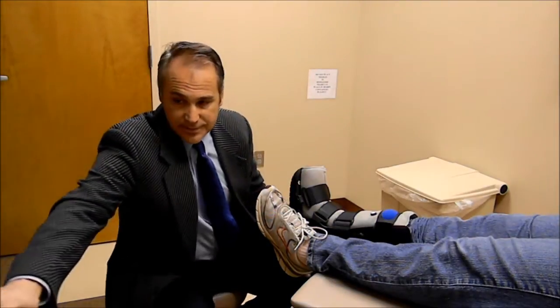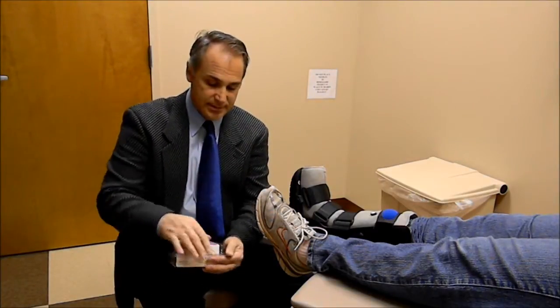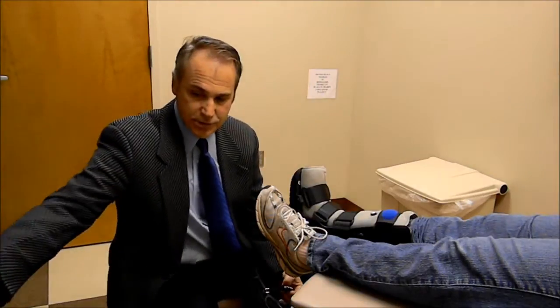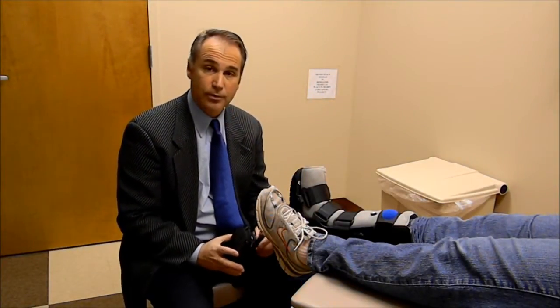They also could only wear that one shoe unless they paid to have another shoe accommodated for the boot. So what we came up with was a simple device called an Evenup. The Evenup comes in basically three sizes and two height adjustments, and it works on either the right or the left shoe.